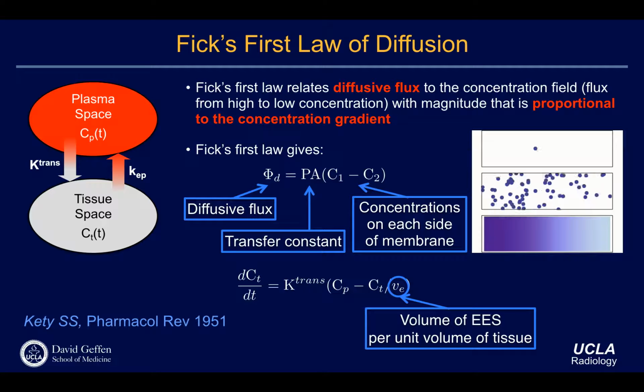Sorry, for DCE, we are measuring the perfusion. Here we do the diffusion model. Okay, so let me cover that later. Yeah, what is the physiological meaning? Here, I didn't say anything about perfusion or permeability or anything. What I'm saying here is that you're measuring a transfer constant, which means how fast it goes from A to B, right?